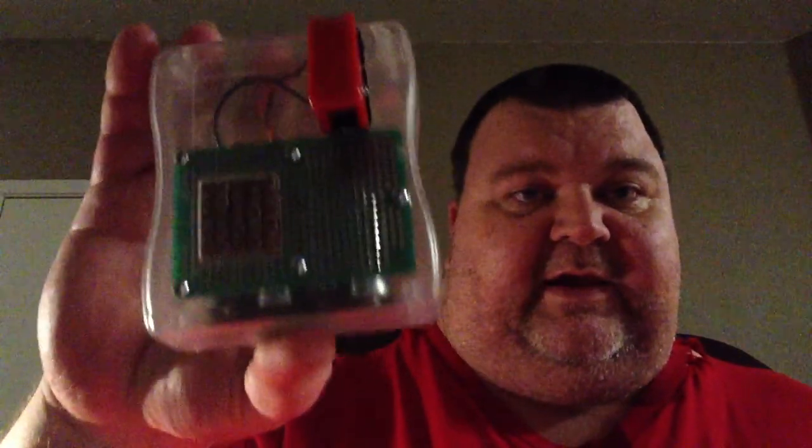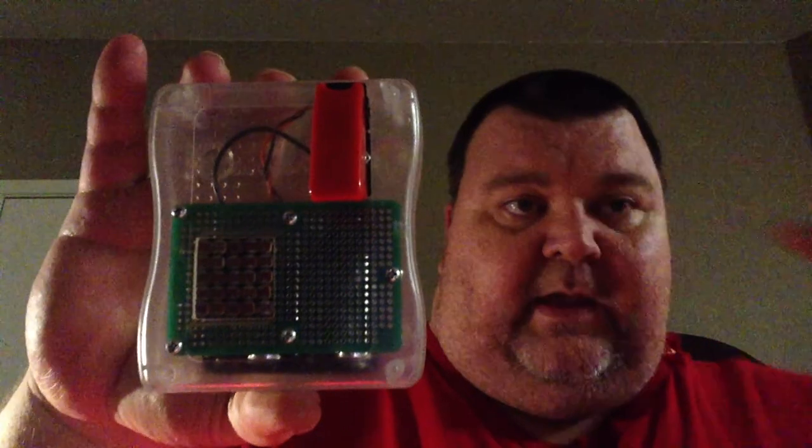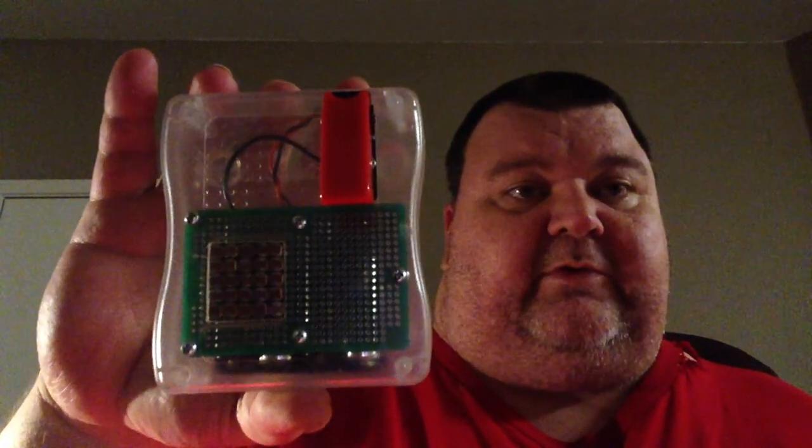Hi, my name is Les Hall, and I'm here to tell you about this thing. This is an invention that I created, and I want to give it to the world. I'll show it to you later, and we'll talk about the details. The purpose of it is to help blind people to be able to perceive images with their fingers.